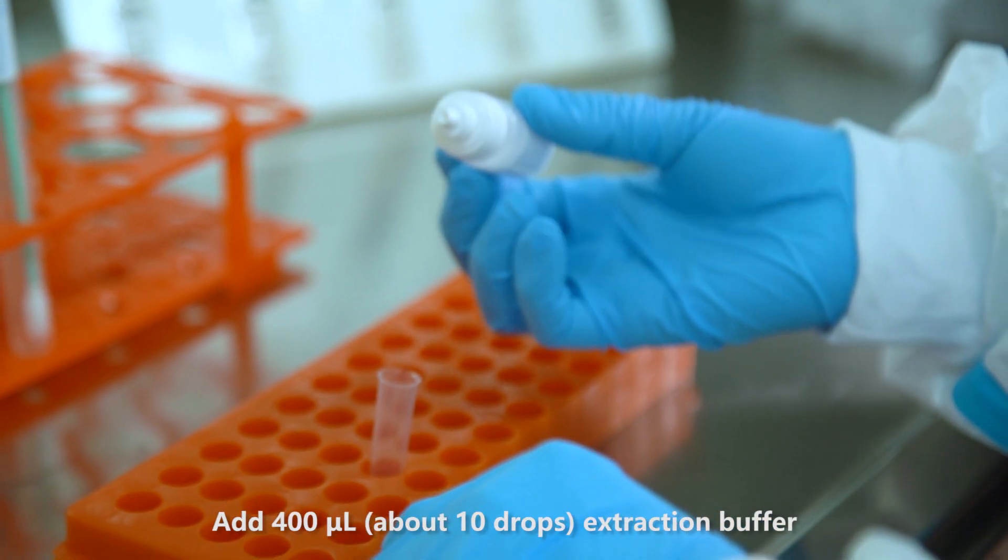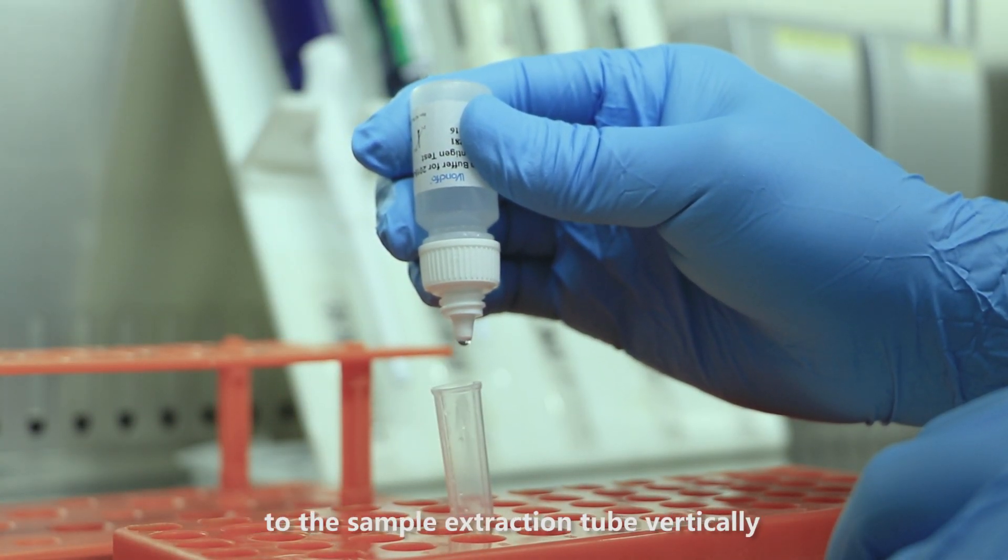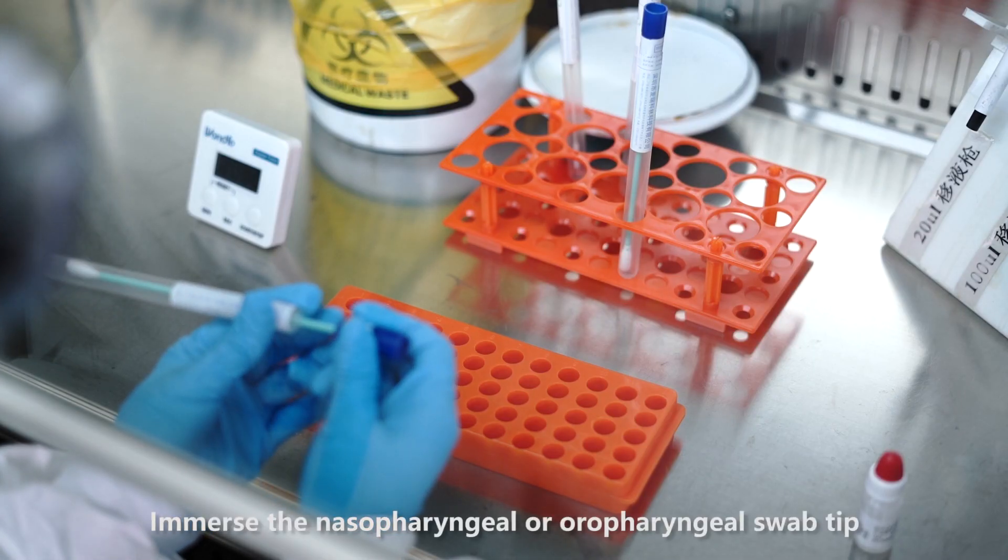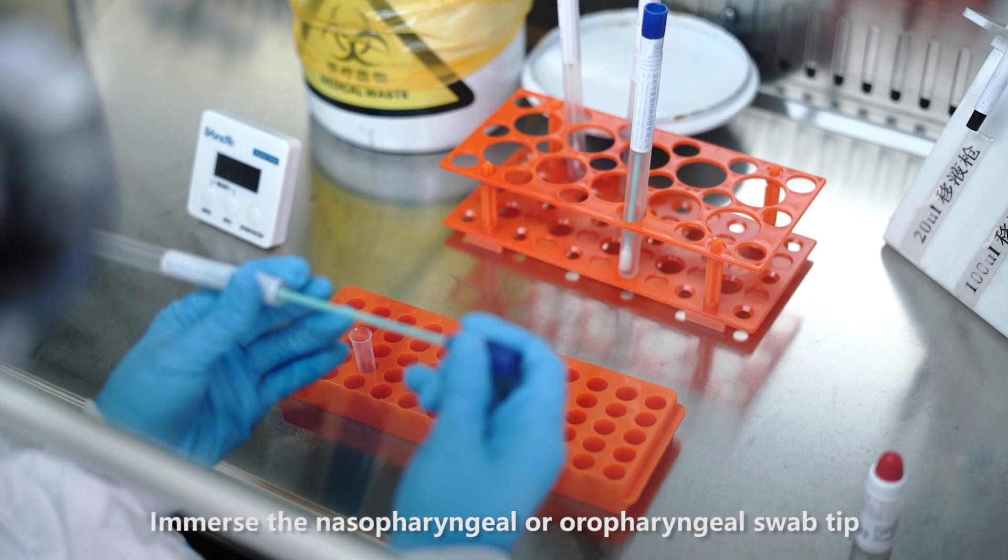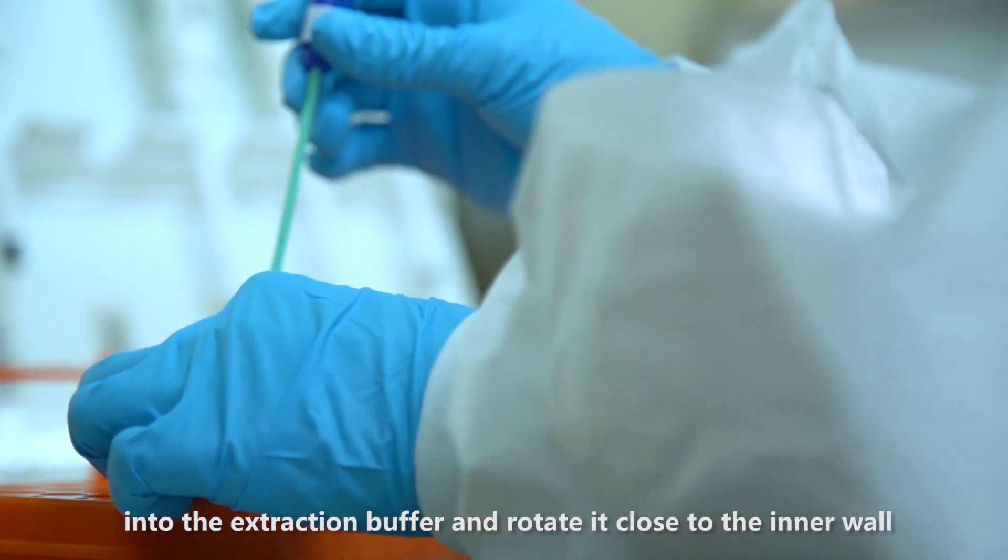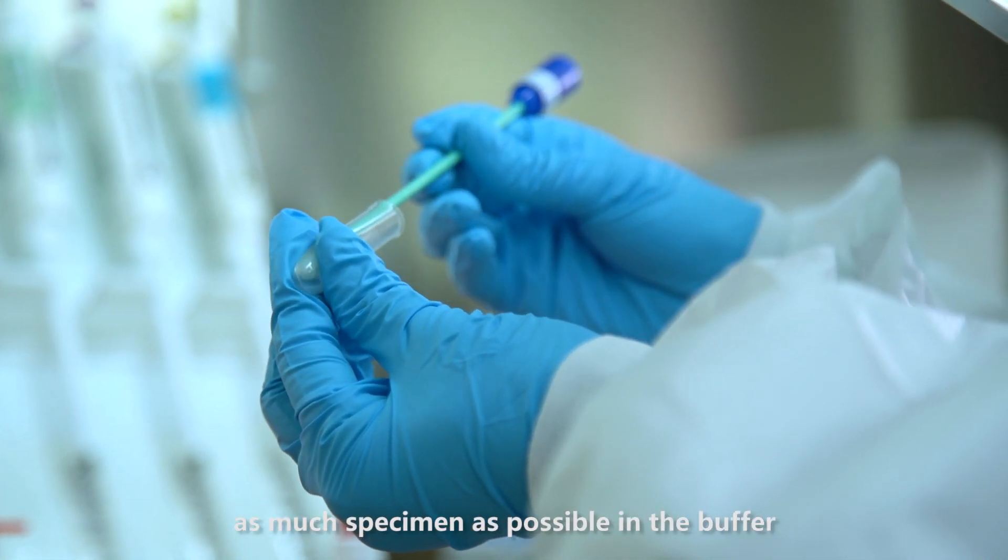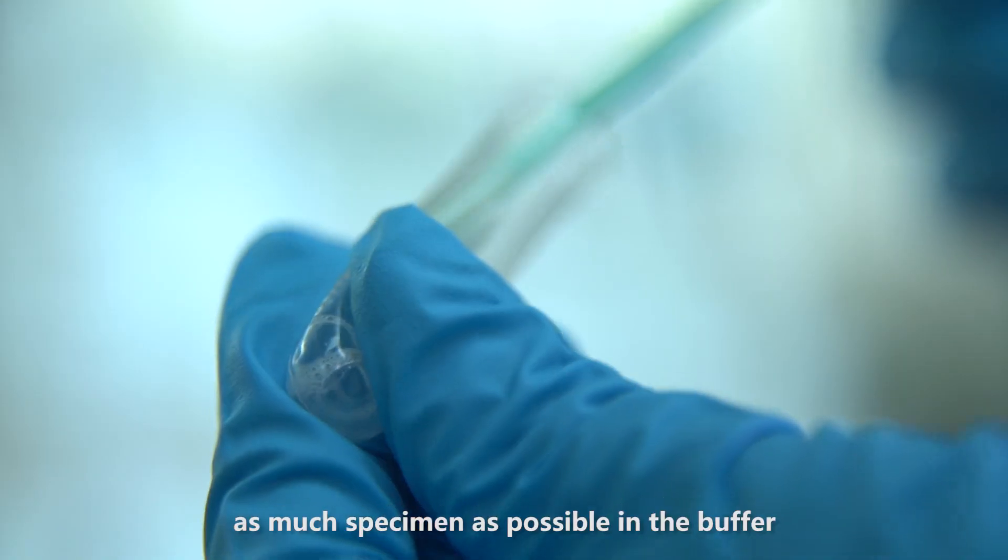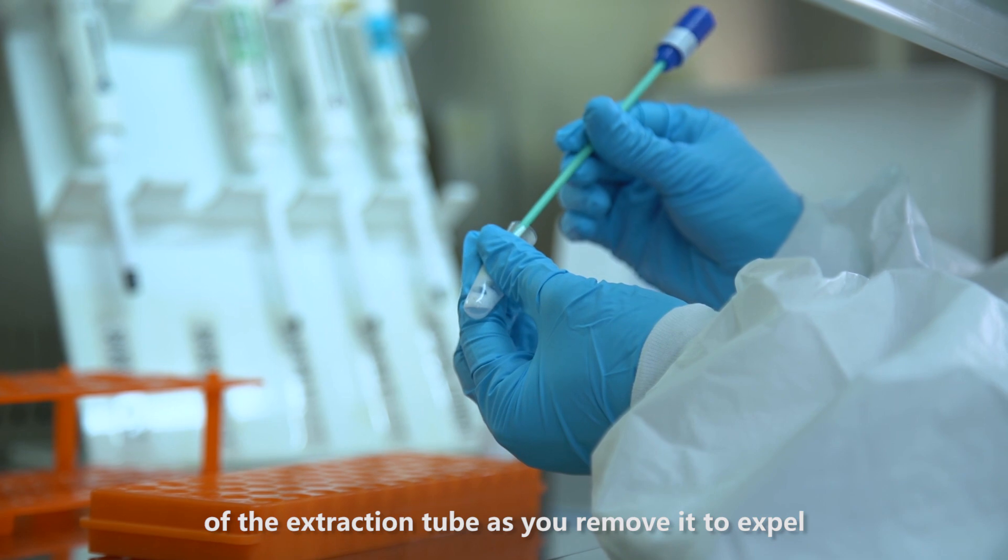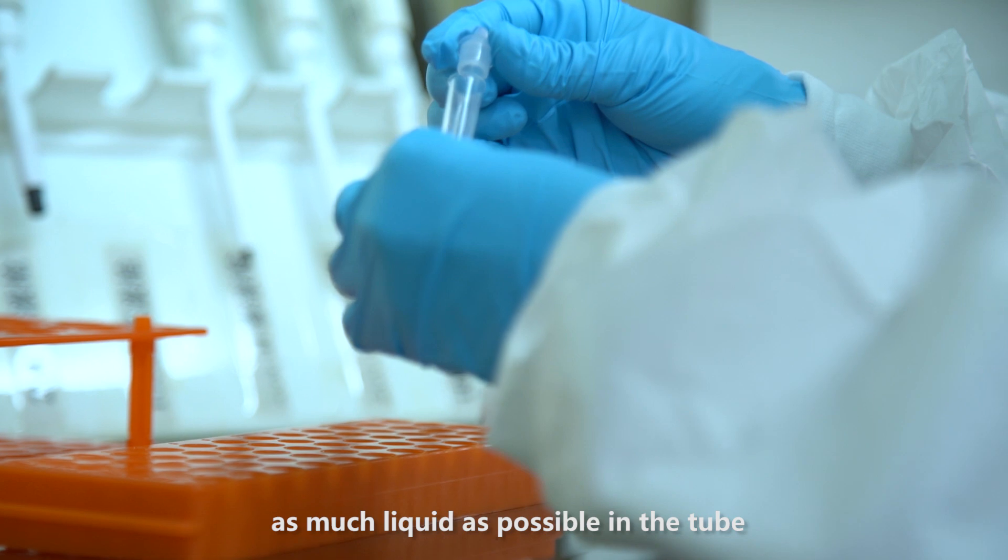Add 400 microliters, about 10 drops, of extraction buffer to the sample extraction tube vertically. Immerse the nasopharyngeal or oral pharyngeal swab tip into the extraction buffer and rotate it close to the inner wall of the tube for about 10 times to dissolve as much specimen as possible. Squeeze the swab head against the inner wall of the extraction tube as you remove it to expel as much liquid as possible in the tube.